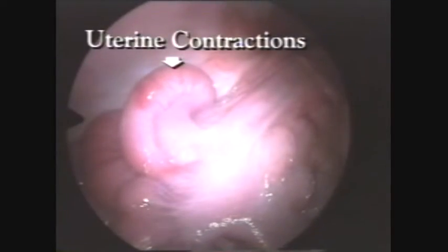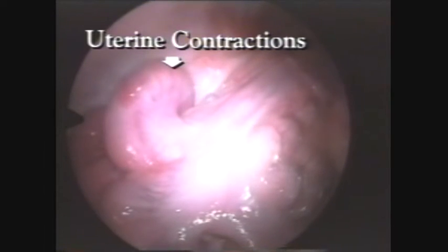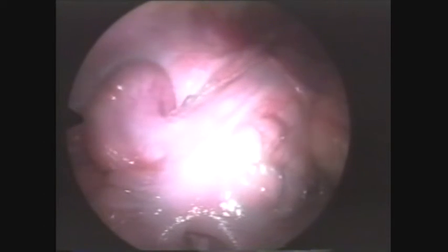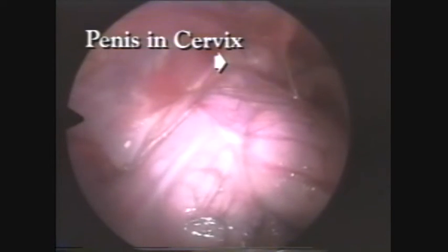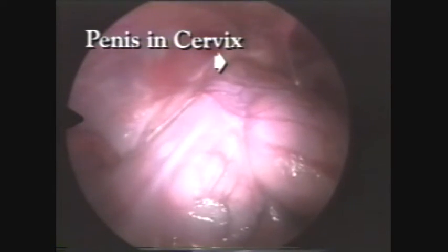Remember that during natural service, the boar stimulates the female by moving his penis within the cervix and with his body actions. This stimulation results in uterine contractions, which are extremely important for adequate sperm transport to the site of fertilization. Therefore, during the AI procedure, it is important to simulate the boar's actions by applying back pressure and by rubbing the female's underline and flanks to provide stimulation and induce the uterine response.